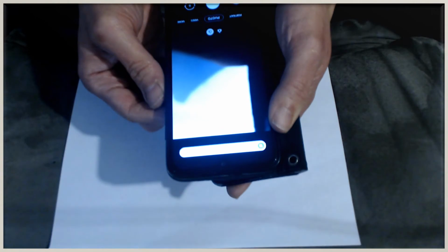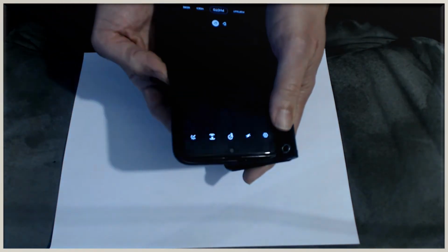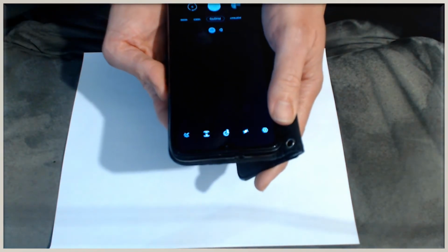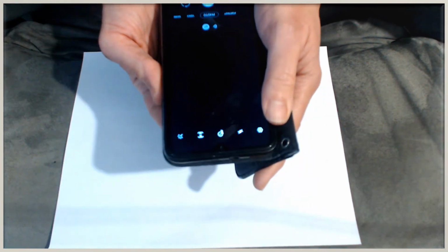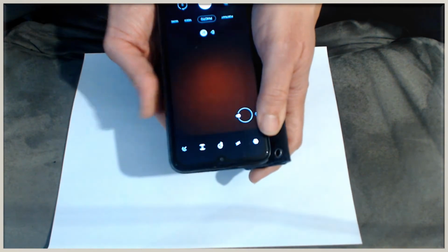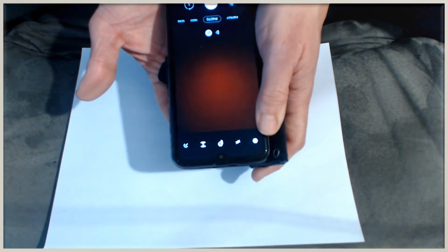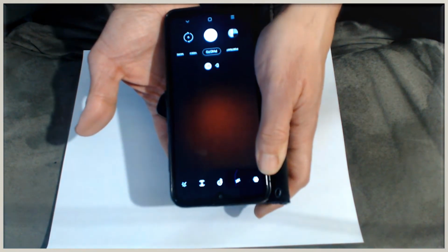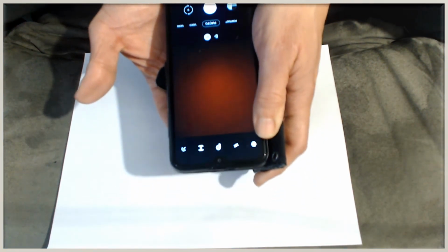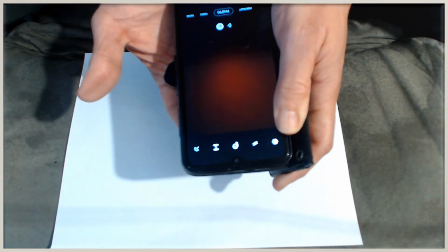We will take a video using the camera while blocking the view with your finger. The idea is that the amount of blood reaching your finger will change depending on your heartbeat, and the intensity of the pixel values in the image being captured will change accordingly. The intensity of the pixels will also change if the amount of light coming from below the finger changes, and changes in the pressure or position of your fingertip will also affect these measurements. Then we will need to do some processing of this signal.